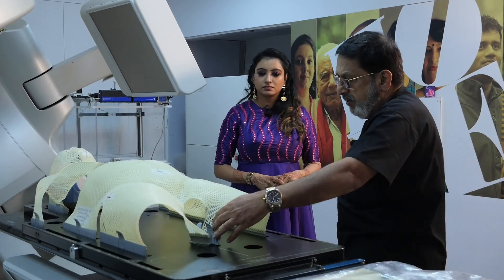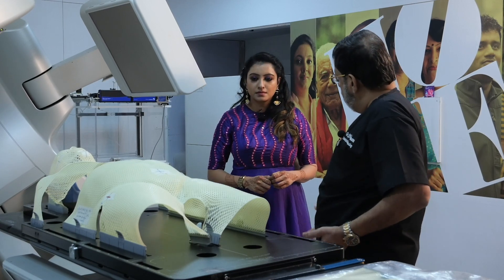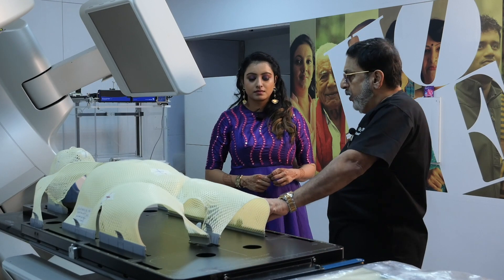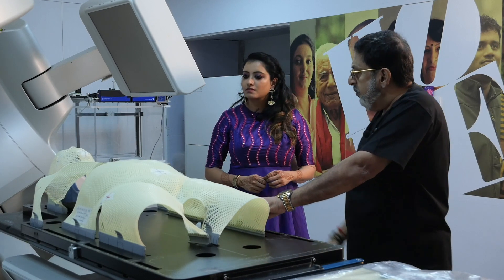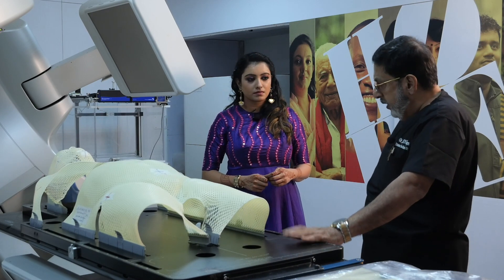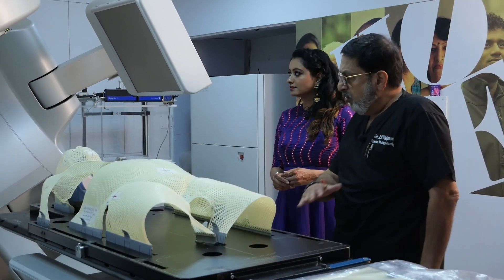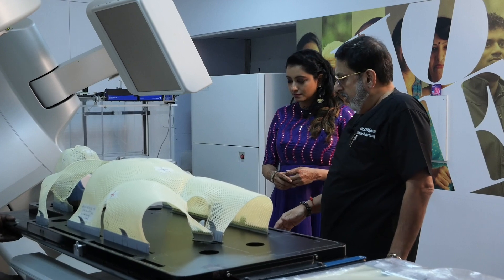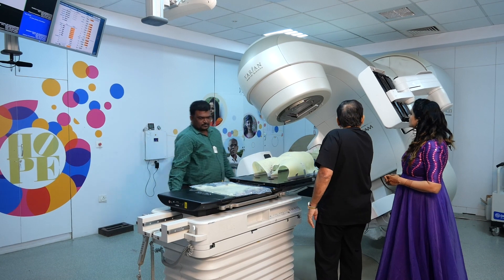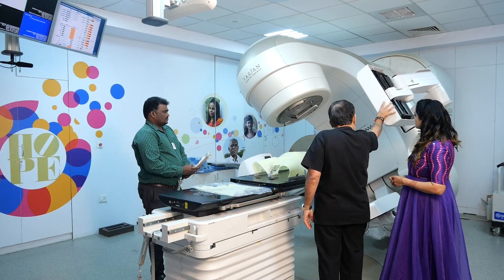Similarly, the pelvis immobilization is like a pant — the patient puts it on like a pant so that he or she cannot move from the position which they are supposed to be in. This is the graduated board, and we know how much to go inside based on calculations done by the physicist. This is how the carbon fiber couch moves inside.